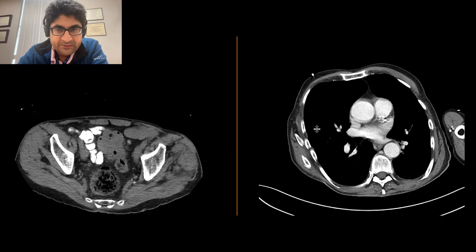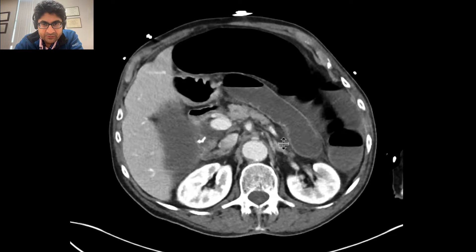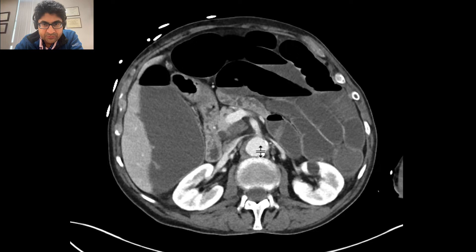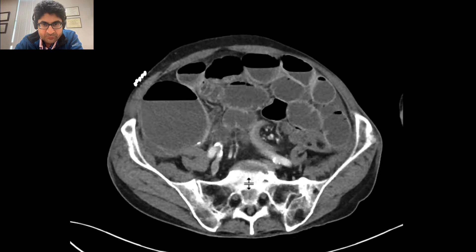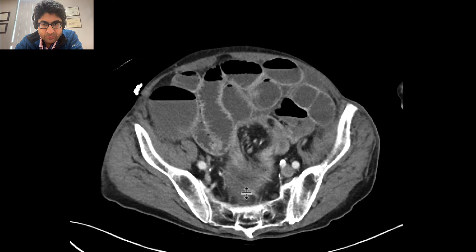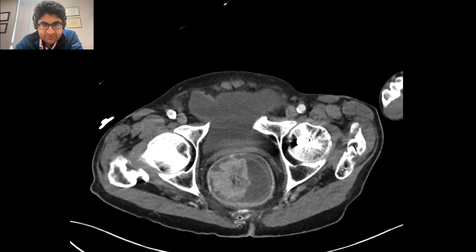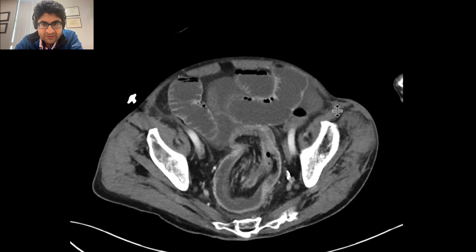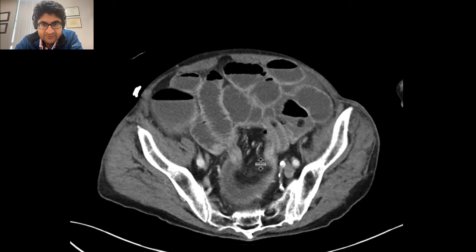Coming back a few days later, now with more pain, we can see clearly multiple distended loops of small and large bowel. Many of them are fluid-filled. As we go down to the sigmoid colon, we can see that that soft tissue mass, nicely delineated with intravenous contrast, is resulting in a large bowel-to-large bowel intussusception.